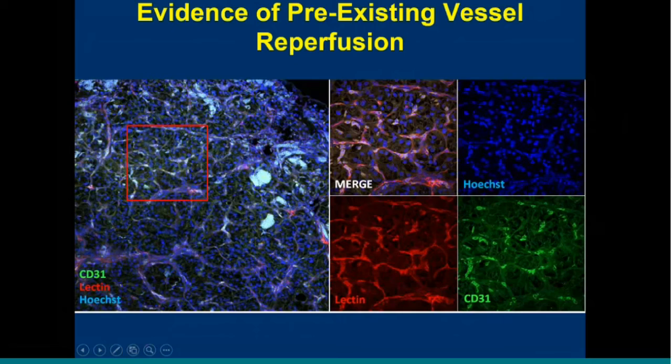So it's interesting to us that we get so much vascularity in these really massive core fragments. So we're talking like just huge chunks of tissue in some cases. So we decided to explore this a bit. It wasn't making sense to us that de novo angiogenesis would produce that much vasculature.